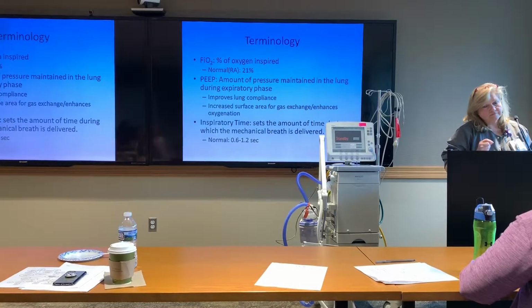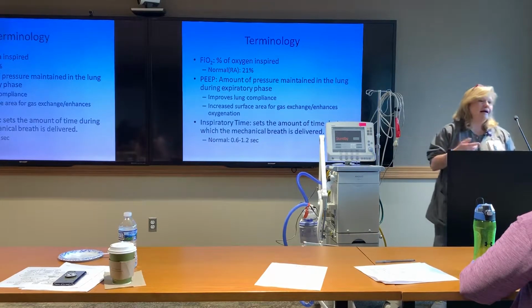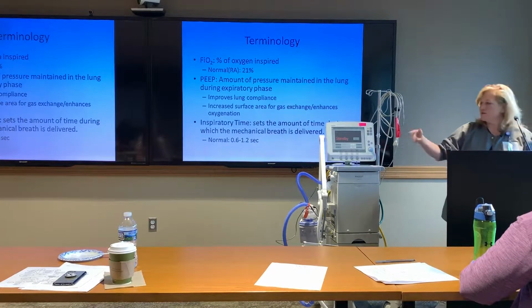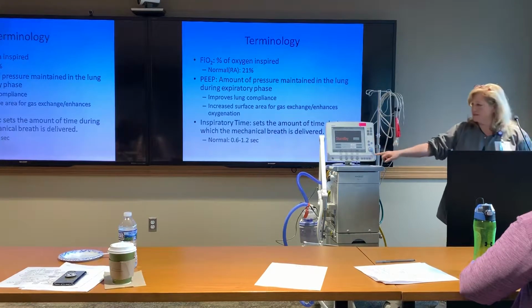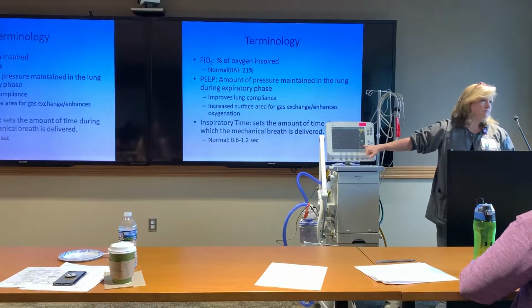Mm-hmm. We should be sending like the set rate. We're not sending their actual rate. Total. You want the total rate and the minute ventilation. I actually will put both numbers down, set/total. And that's why, but that's if you put the minute ventilation and it shows up right there.